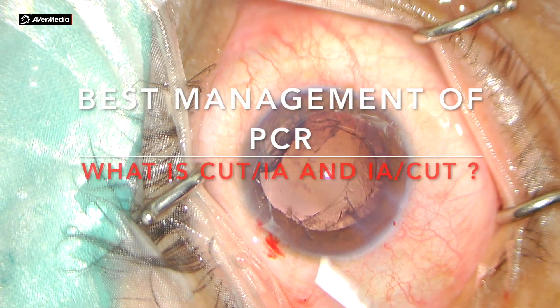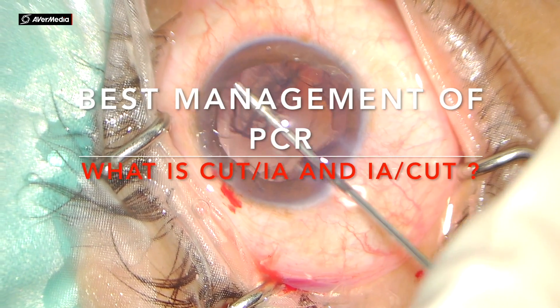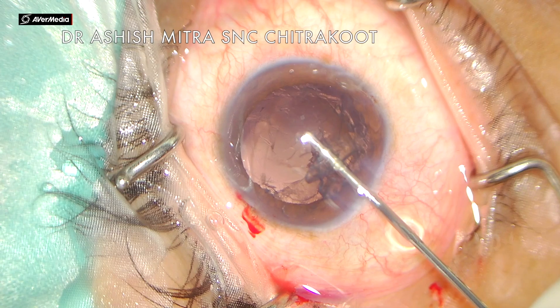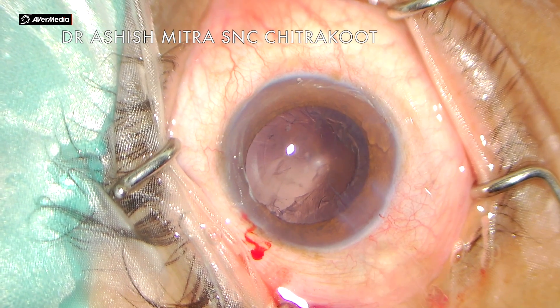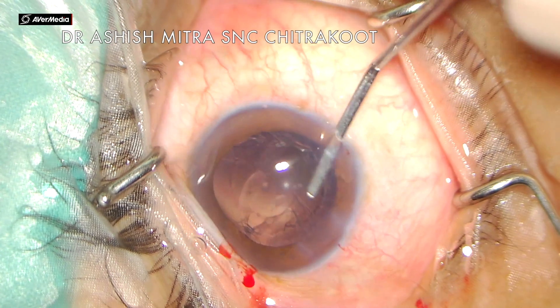Hello everyone, today I'm presenting a PCR which happened in a posterior polar case. You can see the rent margins are visible clearly, and there is some leftover cortex which I'm expelling out with the help of Viscoat. That came out easily because there was not much vitreous disturbance. Let's see how I manage this case.